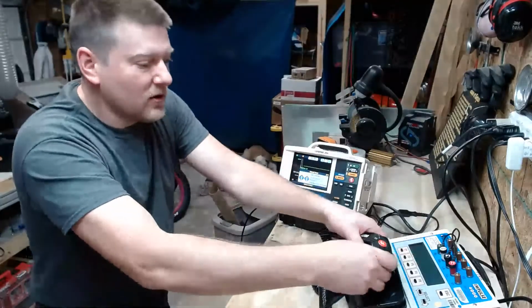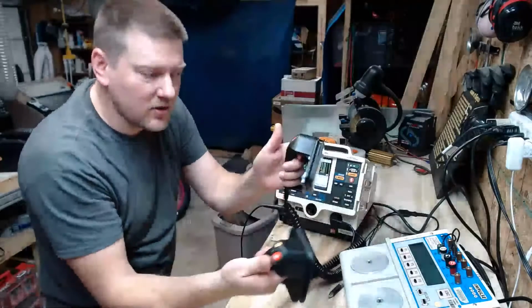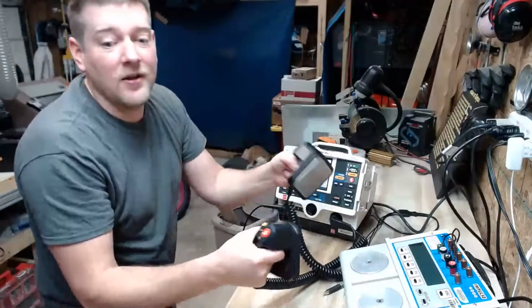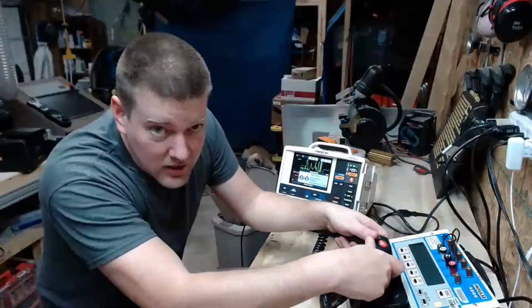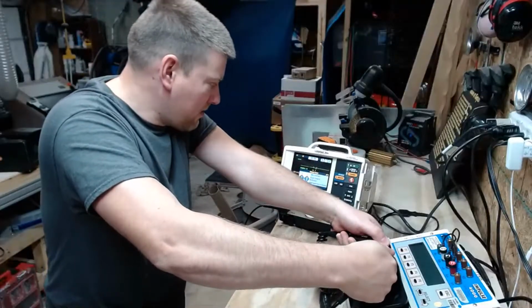Okay? So you can see it tells you to press your buttons. You have to press 2 of them. Notice I press that one, nothing happens. Press this one, nothing happens. If I press them together, they're going to discharge. Do not discharge in the air. Always discharge through your analyzer. Ready? Go.